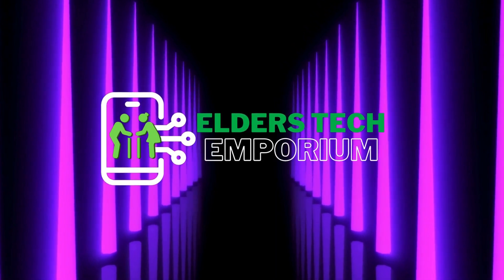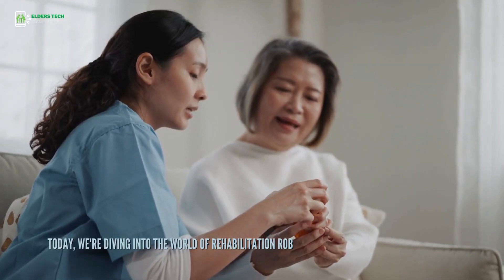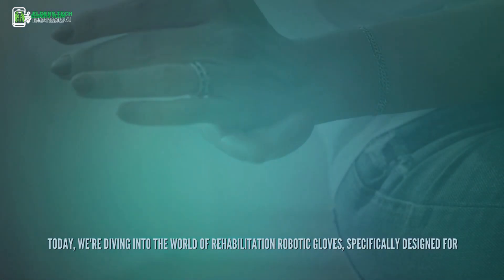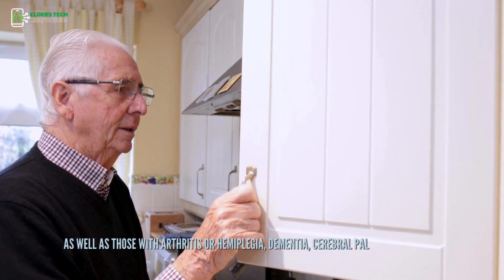Hello, everyone. Welcome back to Elders Tech Emporium. Today, we're diving into the world of rehabilitation robotic gloves, specifically designed for stroke recovery, as well as those with arthritis or hemiplegia, dementia, cerebral palsy, or nerve injury patients.